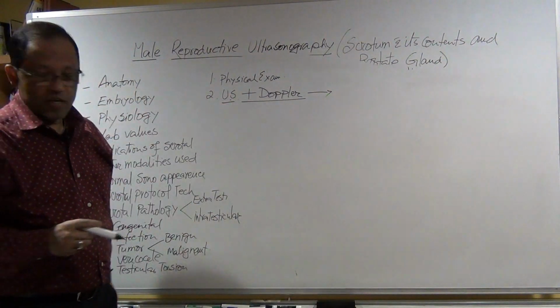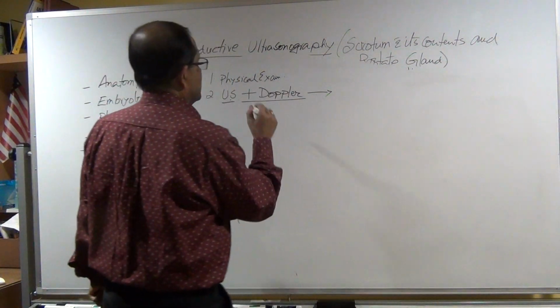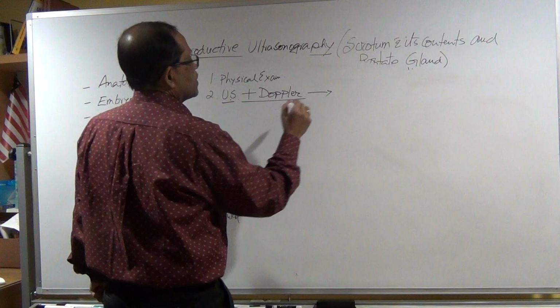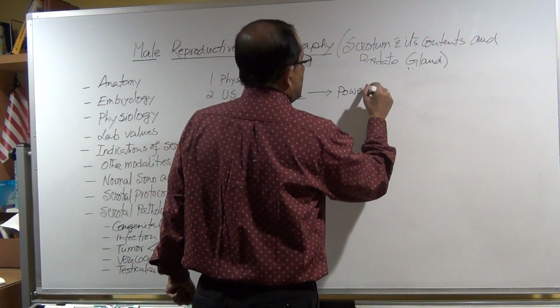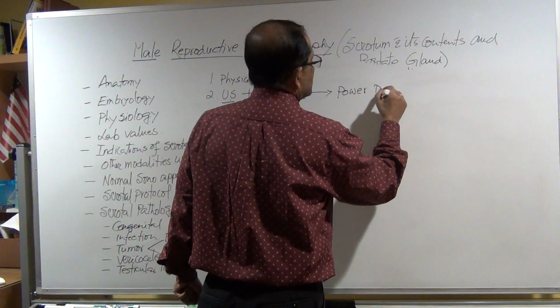With the Doppler, keep that in mind, we will use the power Doppler.